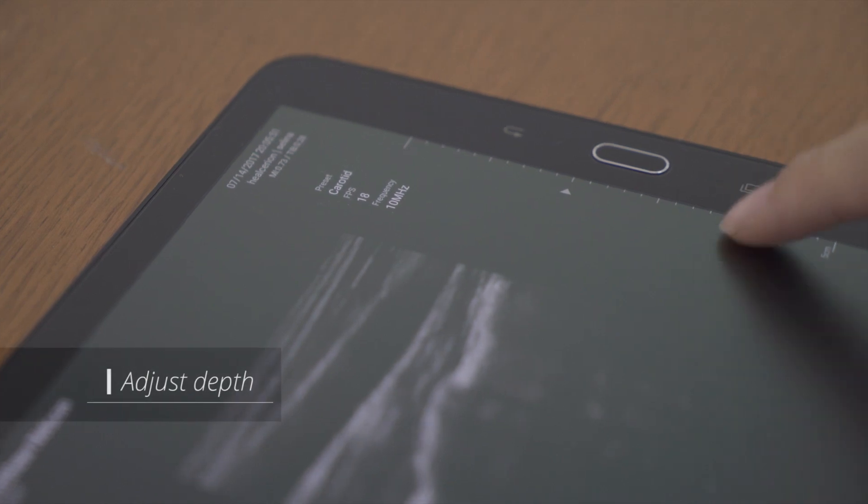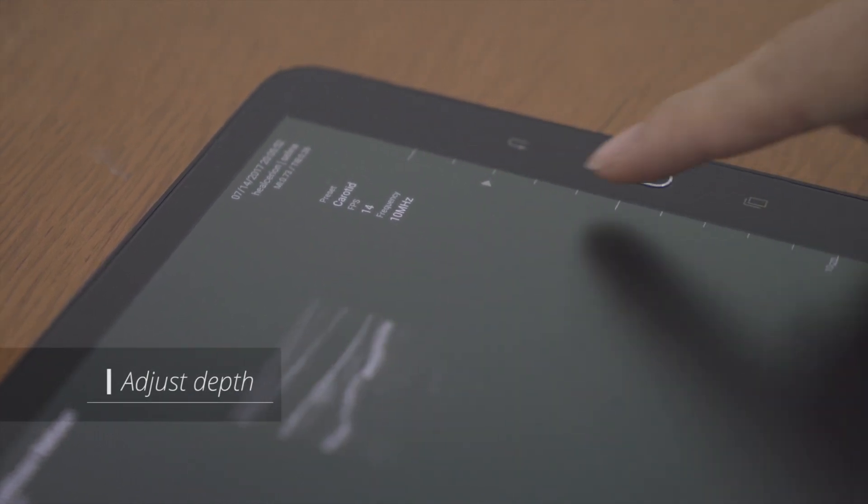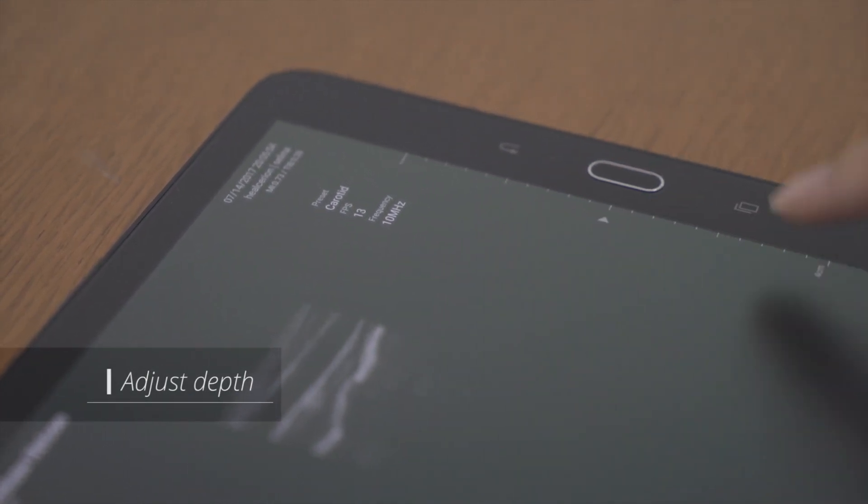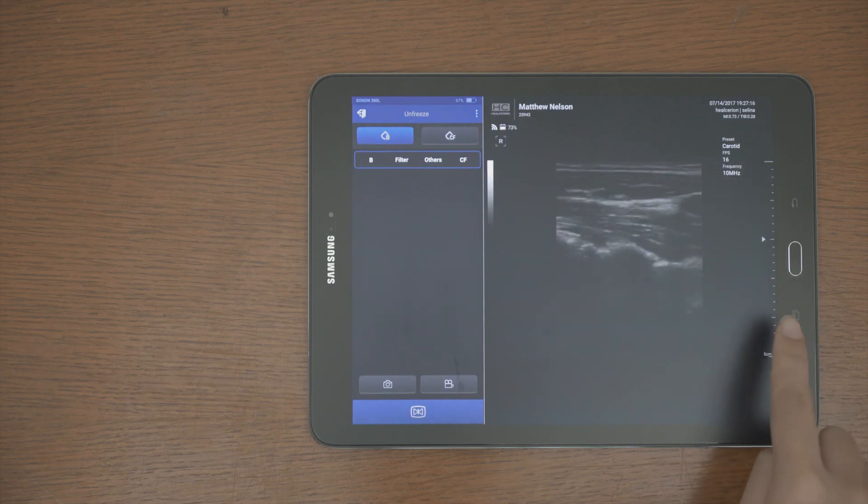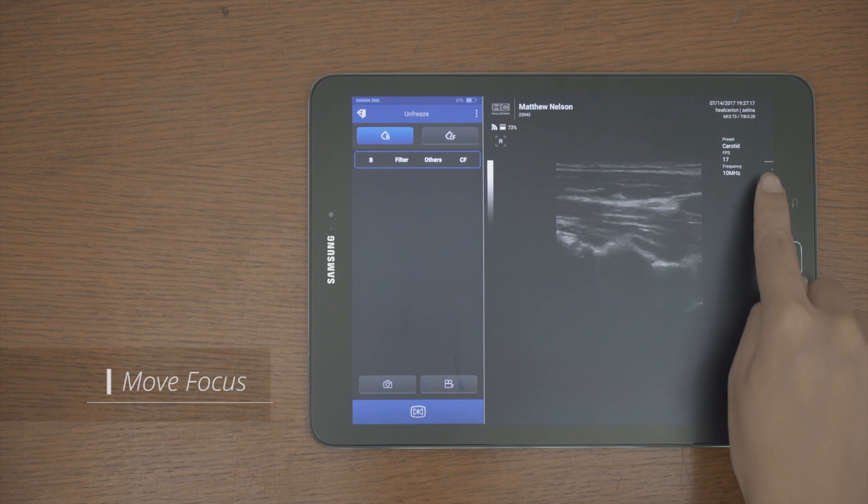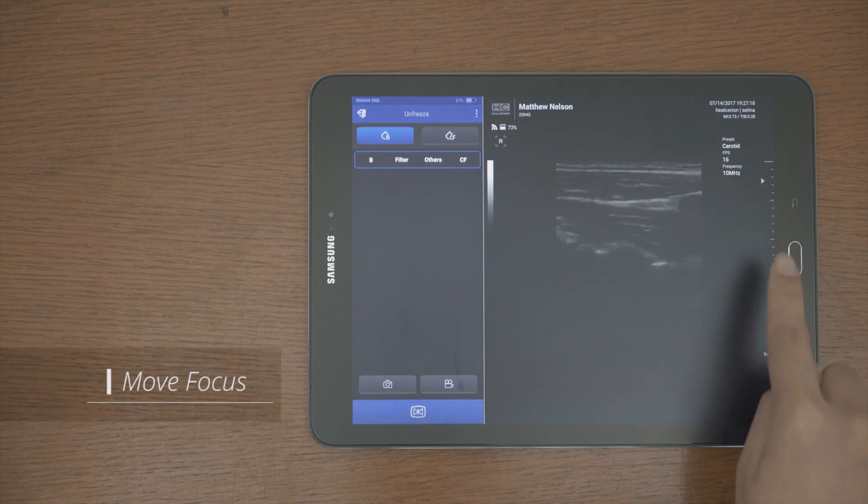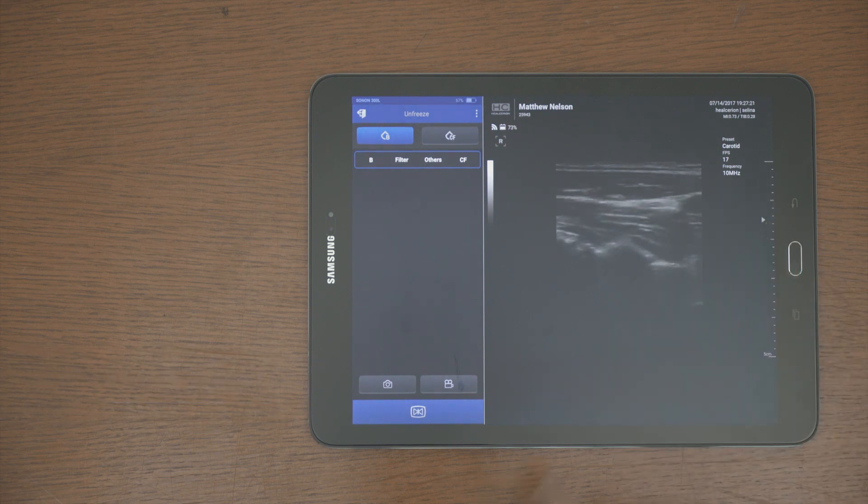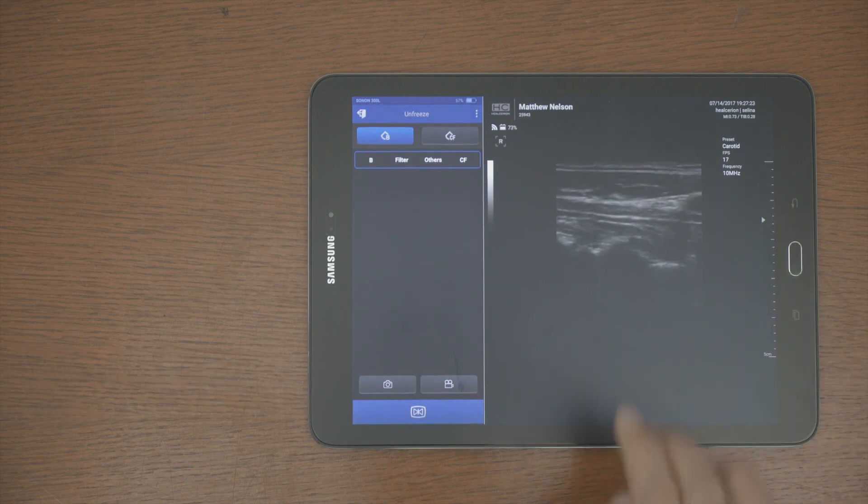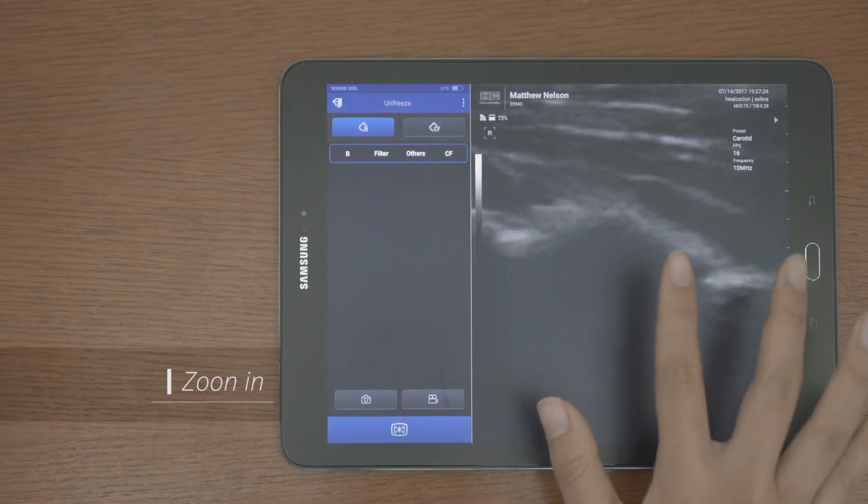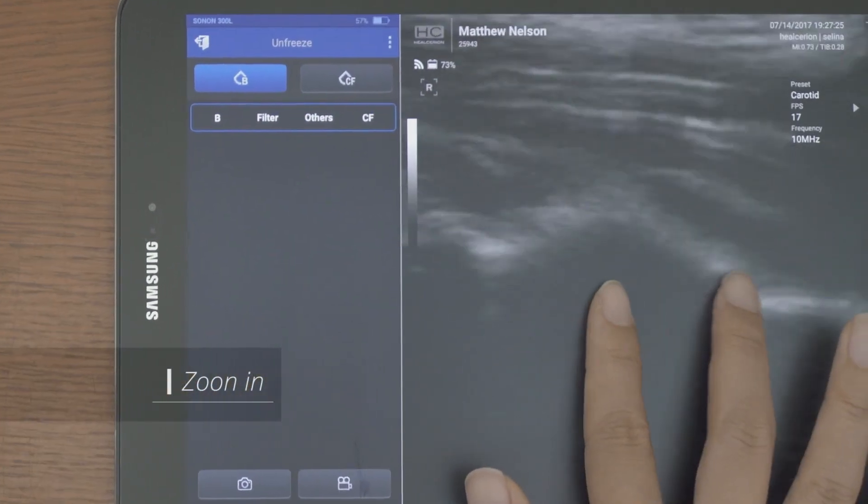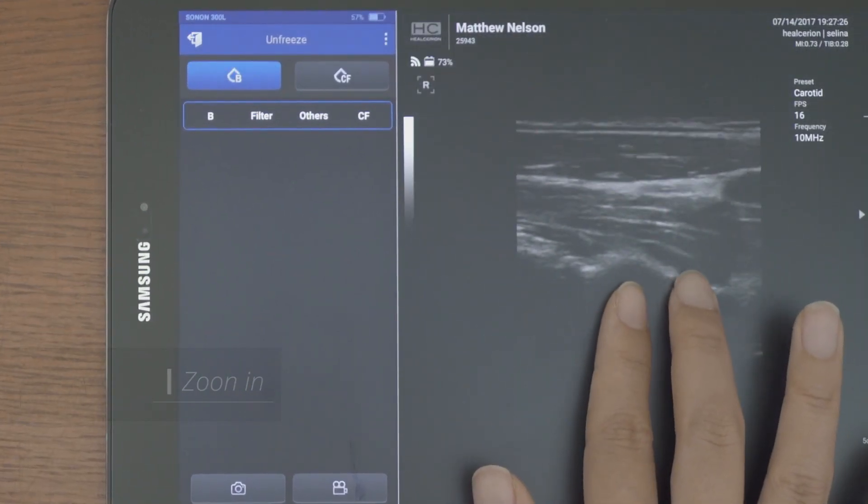You can adjust the depth by dragging the bar. And the focus moves when you tap on each part. You can also zoom in on the screen.